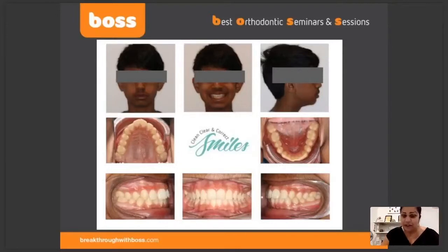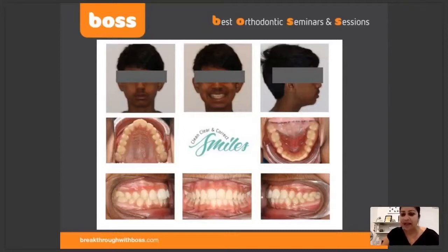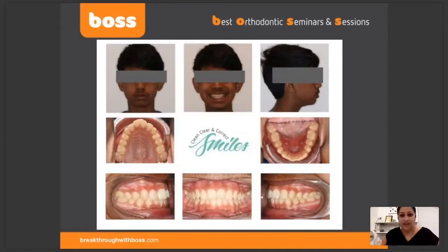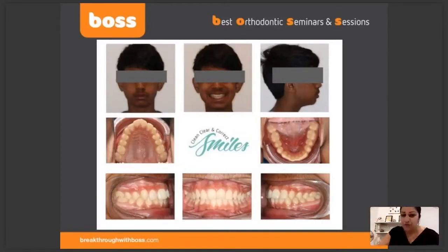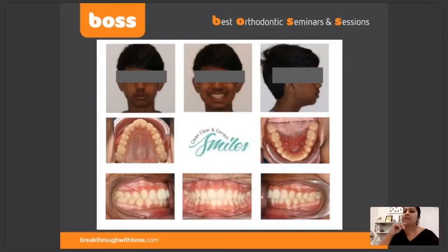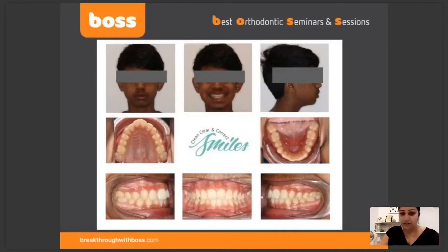Then we take a profile shot — very important to take an unstrained position as well, with the patient looking in a natural head position. You don't want their head tipped down or tipped up; it has to be natural head position.